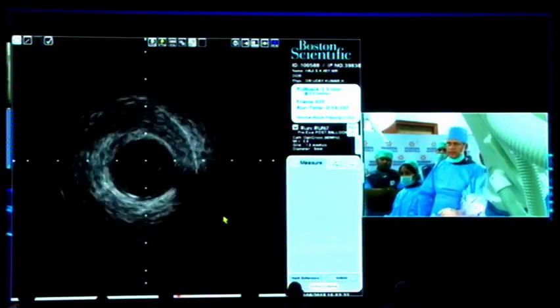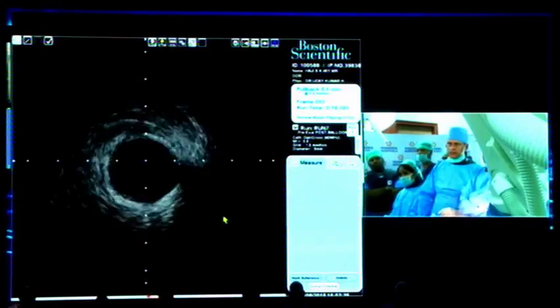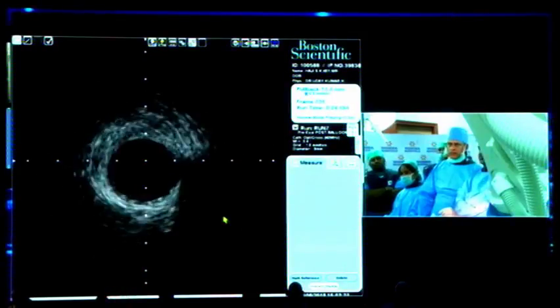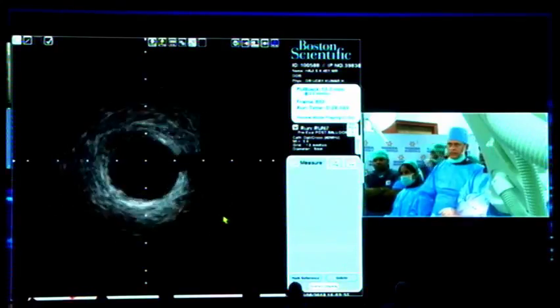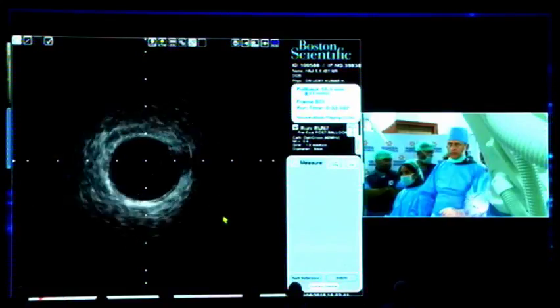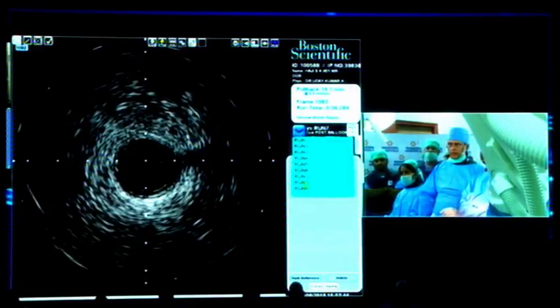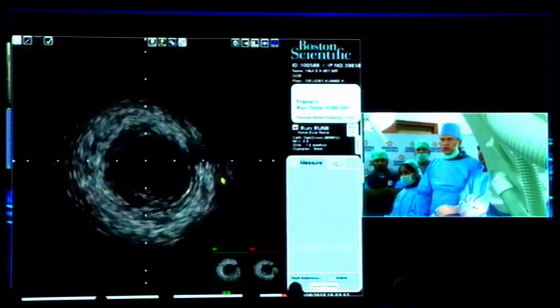The vessel down is not that big, but proximal, mid segment, mid distal, it's a 3.0, then 3.25 for the proximal. So here we are all through lumen. Good, we don't enter the false track. So all through. Run 8. Next, please.